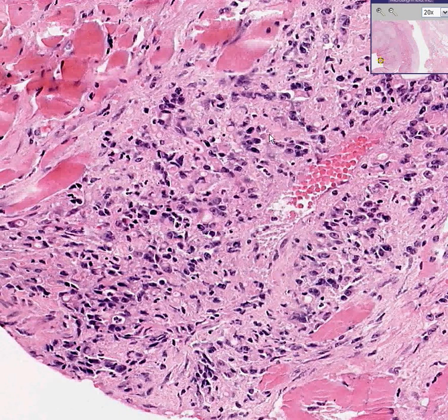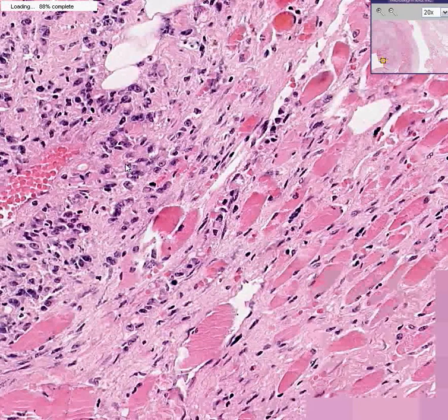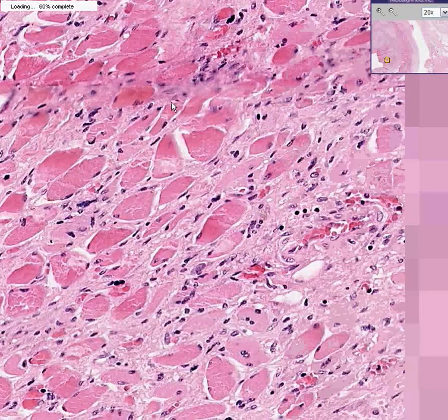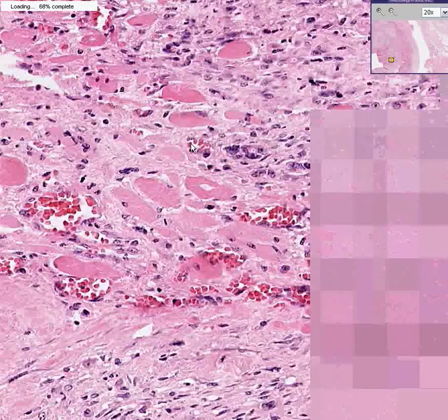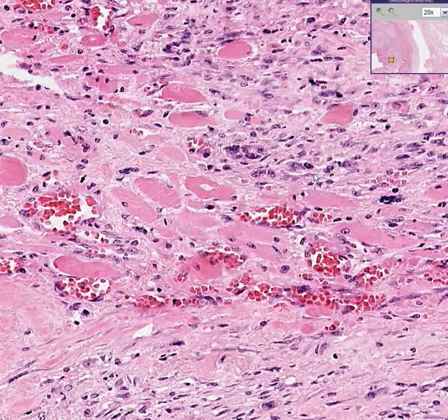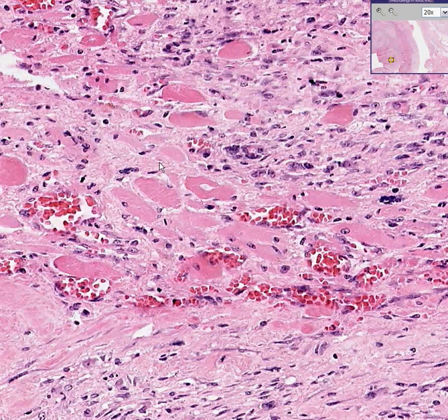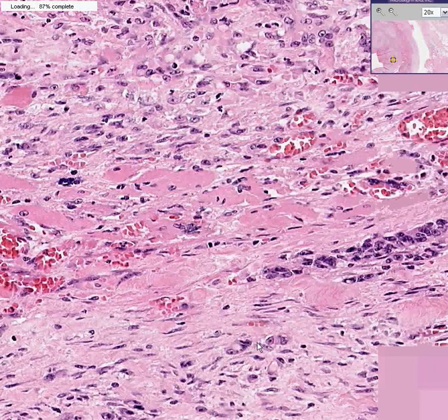Let's travel all the way throughout the thickness of this leather bottle stomach and find some more diffuse tumor. Here's some tumor nests over here, here, here. Notice not only is there a significant amount of true dense fibrosis associated with these tumor nests, but the whole histology of the stomach is very subtly disrupted. All of these are smooth muscle fibers which are kind of choked off or invaded by these tumor cells. Here are nests of tumor cells infiltrating almost like an Indian file pattern, like we saw with breast cancer.